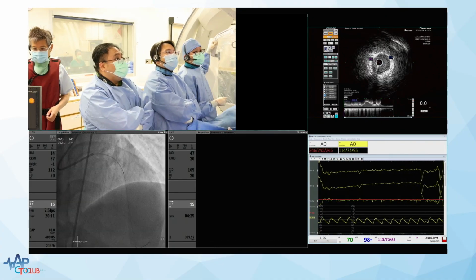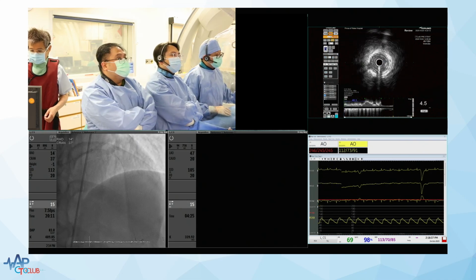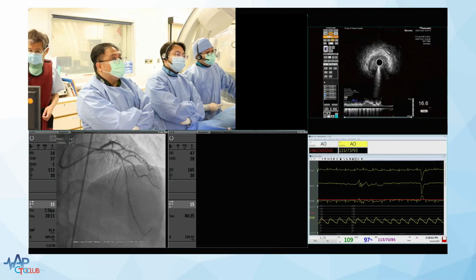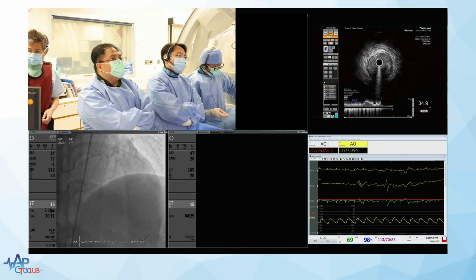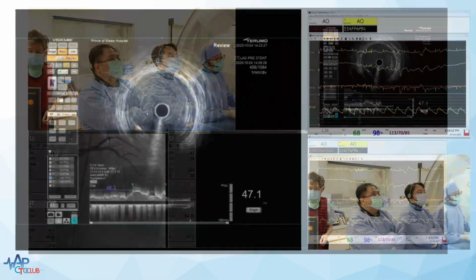So Eugene, should we pull up and play the IVUS? Yeah, IVUS. This should be it. Actually, this is the IVUS run through. You can see this perimedial brightness a little bit. So a little bit shrunken the distal LAD. This is full of plaque, unfortunately, and you can see this is the bifurcation.